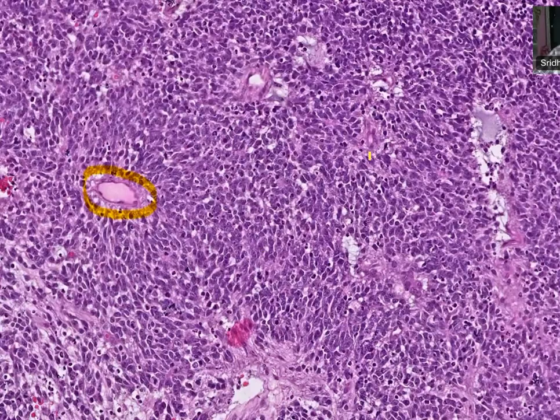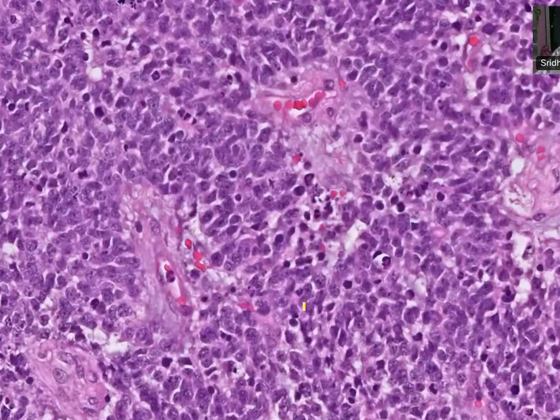What's your differential here? If you want to club this tumor or assign a family of tumor, what tumor will you call? Sir, because of the age group and because of the apoptotic bodies plus high mitotic index, I would like to place it in embryonal tumor. Very good. So again, this is an embryonal tumor, which is very packed, very highly mitotically active, as you said.